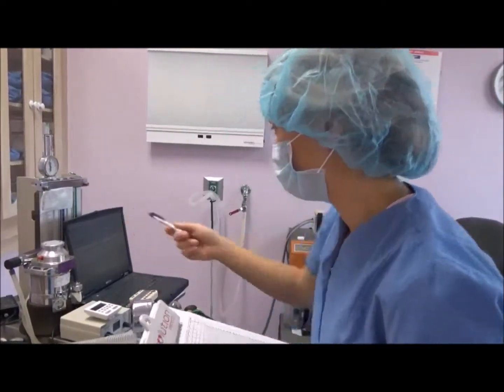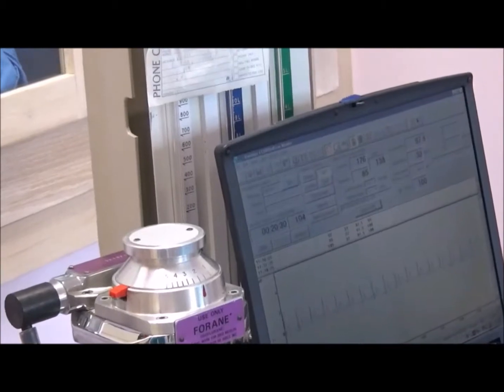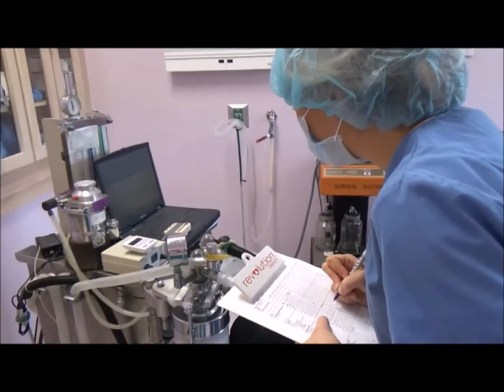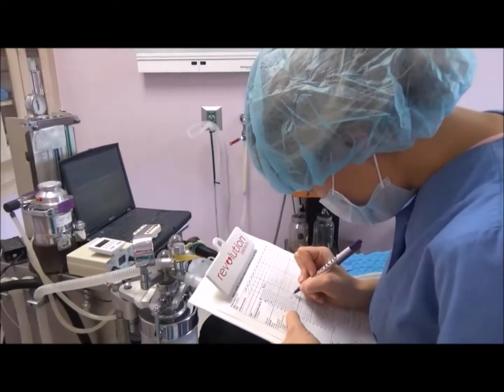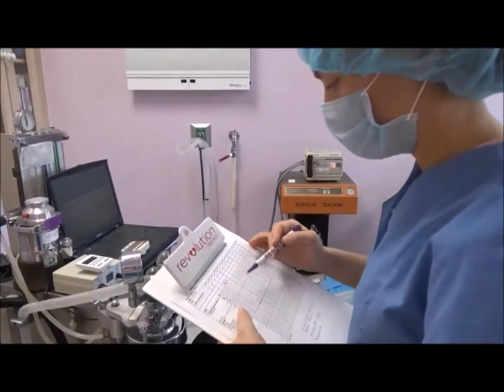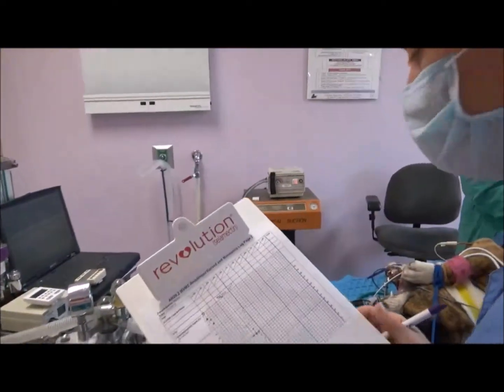But the systolic is 176. Diastolic 85. And mean arterial pressure 138. Pretty close to the next temperature check, so I'll make a note of that. So it's 97.5. So that looks good.